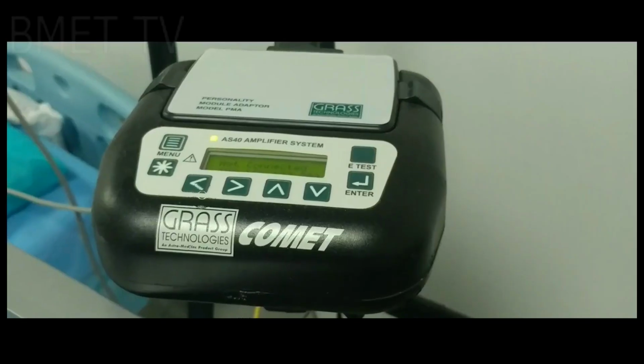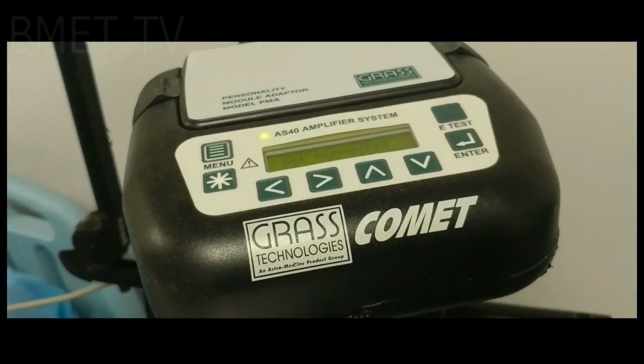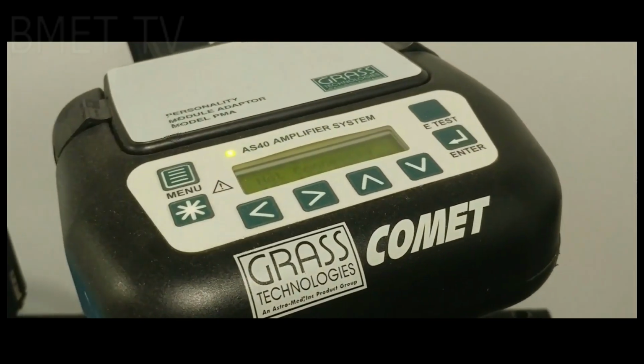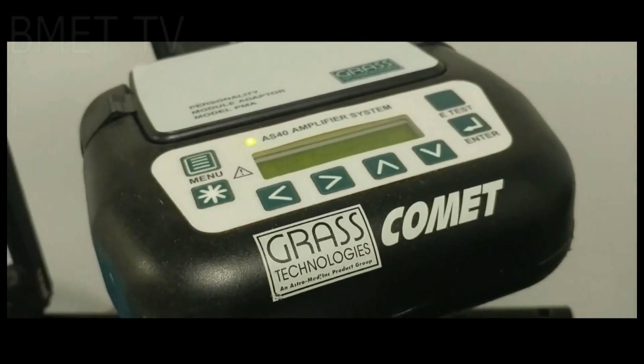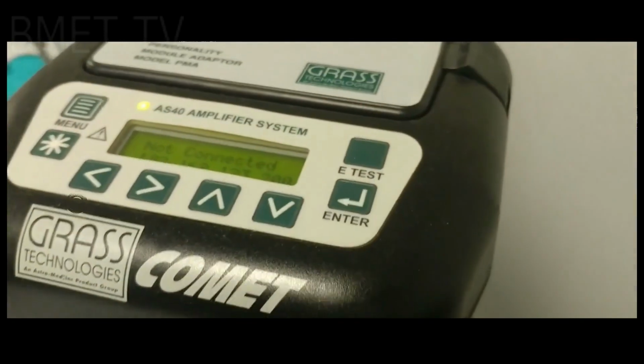Second is amplifier in EEG machines. The EEG amplifier is the part of the data acquisition system responsible for accommodating, amplifying, and converting the analog electrical signals from the sensor into a digital signal that can be processed by the computer.